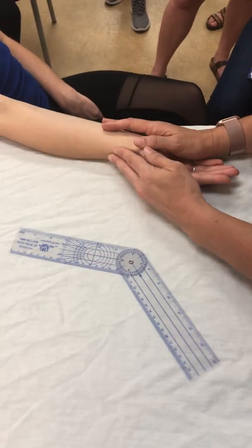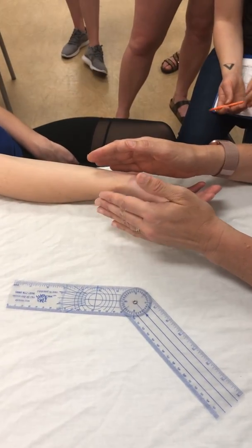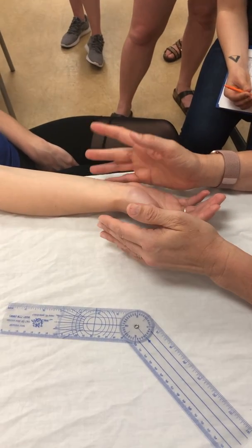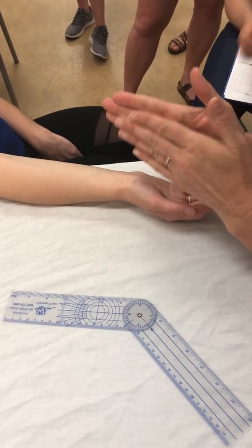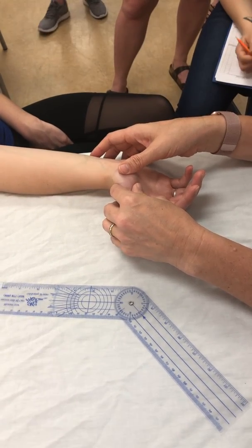So what did I say the first number was? 36. So 36 becomes 0, and then we take our 42 minus 36, which is 6. 26, thank you, okay. The starting was 26? Okay. But we're going to document that as 0 to whatever that math was, okay?